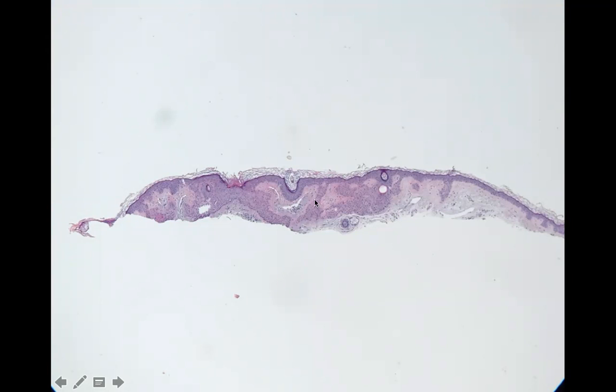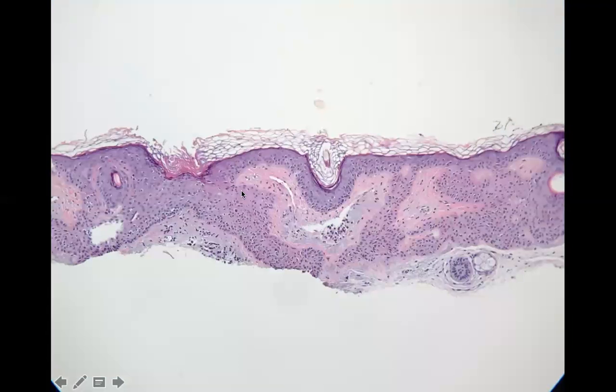But when you go in close, you can see that the infundibulum is this color. So if all of this part looked like this color, you would really have a seb. But you can appreciate that these cells are slightly plumper and slightly pinker. And if you go back to the slide where we talked about the different areas of the follicle, you would see that slightly plumper, slightly pinker is the isthmic portion where the sebaceous lobules and the pilorector muscles insert.